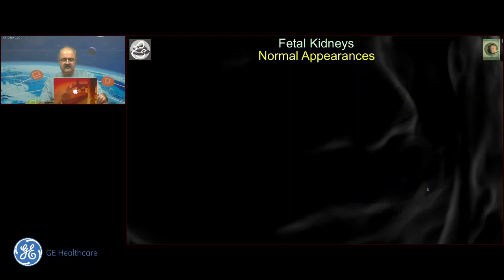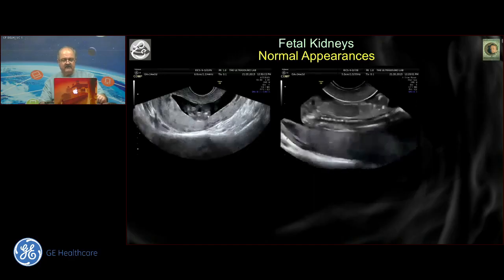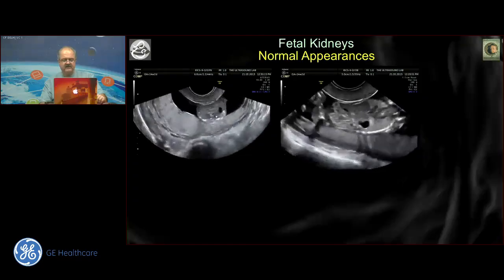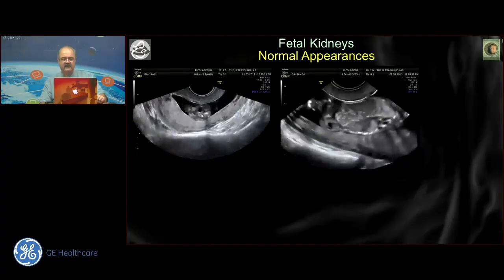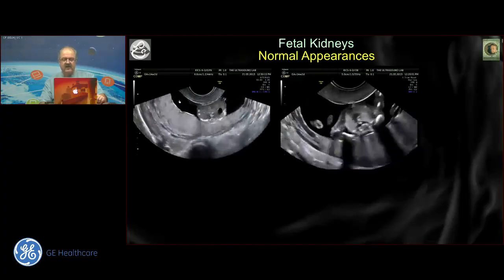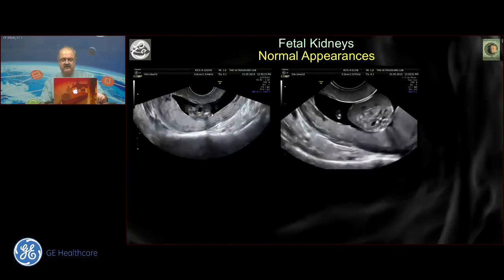The tendency for many of us not to magnify is a little difficult to understand. We often give images like this where we say, oh yes, this is beautiful, I see iliac wings, I see the kidneys here, I see stomach here, and so on. But it's not wise to do things like this. We must make sure that the area of interest occupies most of our screen, and that way you should be able to see it much better.